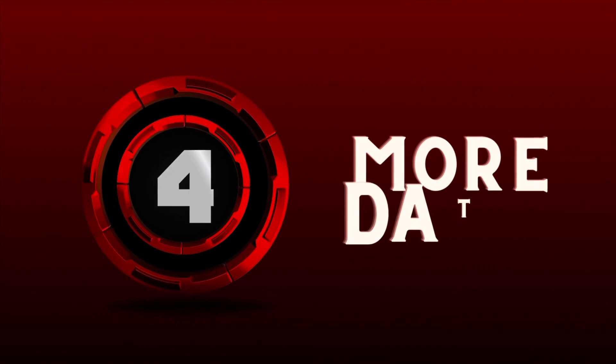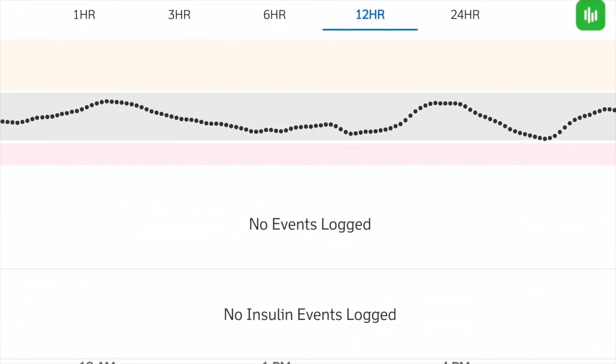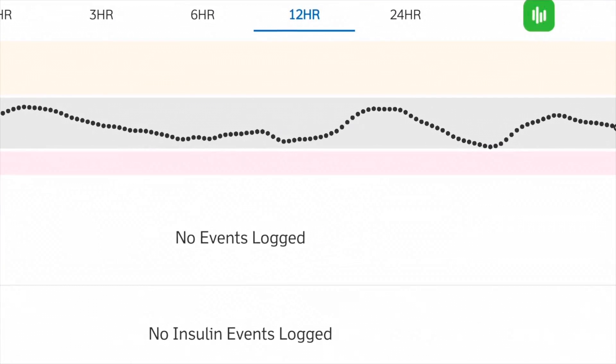Number four: more data. The Dexcom app is kind of limited in the data you can see — you're basically limited to the last 24 hours of CGM values. And if you didn't know, if you turn your Dexcom app to the side in landscape mode, you can see your full 24-hour picture of all your glucose values. That's another little tip in itself, but not the main tip I'm talking about now.